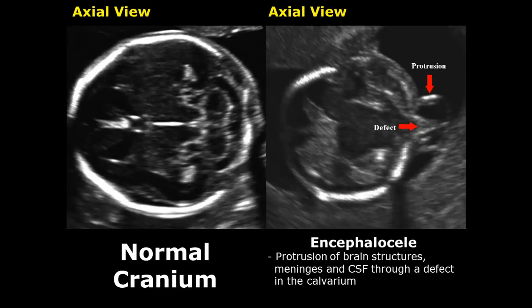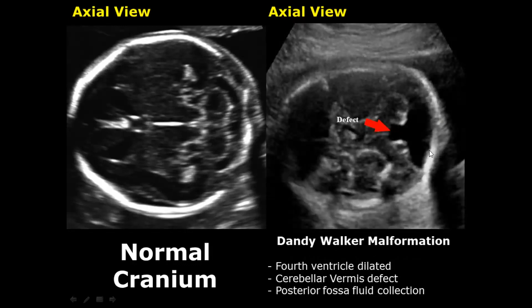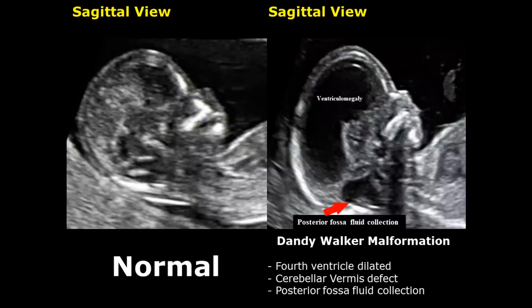When there is a protrusion of brain structures, meninges, and cerebrospinal fluid through a defect or hole in the calvarium, this condition is called encephalocele. This is the protrusion of brain tissue and meninges, and the defect must be present in this area. Dandy-Walker malformation is associated with the posterior fossa — there is a defect in the cerebellar vermis leading to fluid collection in that area, along with ventriculomegaly, as seen in this sagittal view.